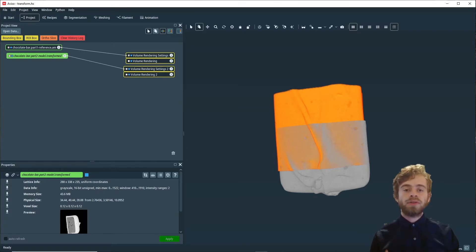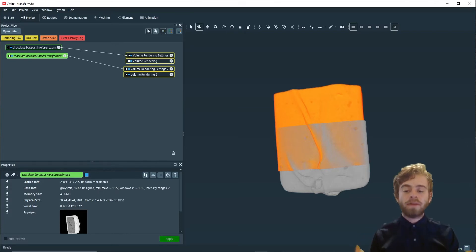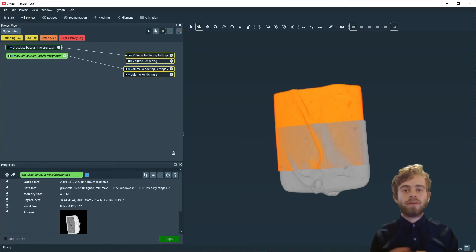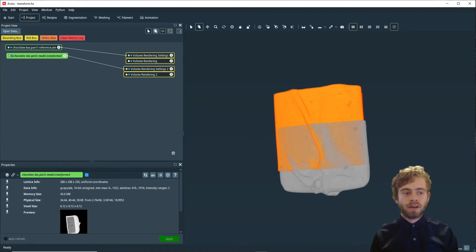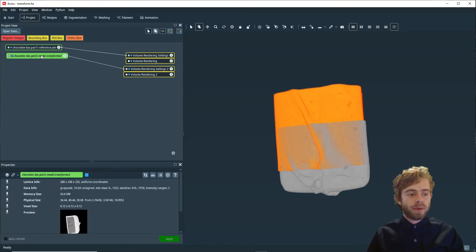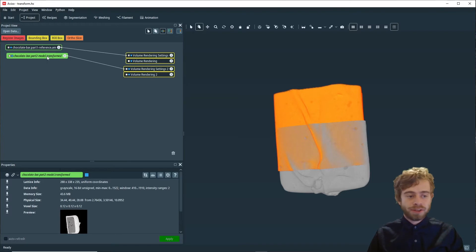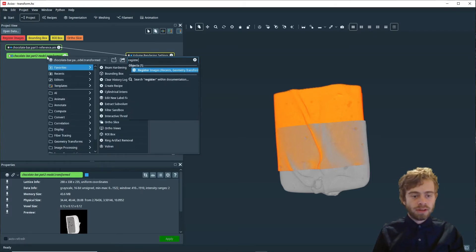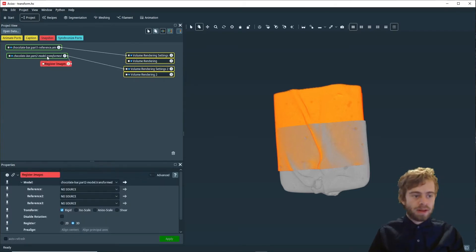We're going to use this approximate alignment of the two parts of the chocolate bar dataset as an initialization point for our register images module. First, we're going to right click on chocolate bar model dot transformed and search for register images, and there we go.